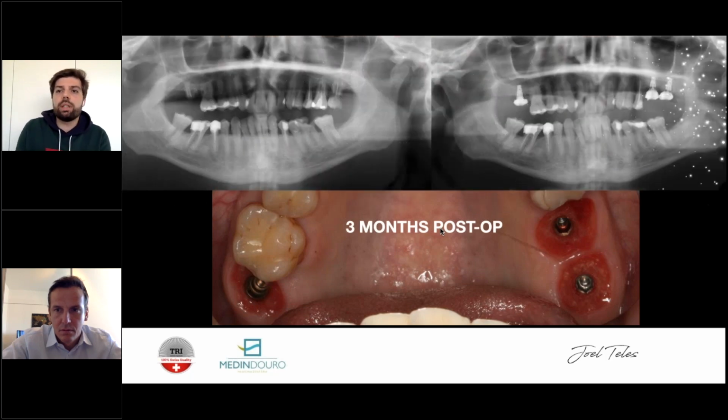You can see here, even in this X-ray, the before and the after the surgery X-ray. We've done these three teeth, and you can see here that in this tooth right here, we had like 4 millimeters high. Here it was less; it was more or less 3, and here in between 4 and 5.